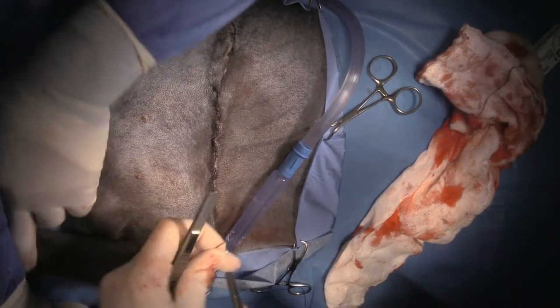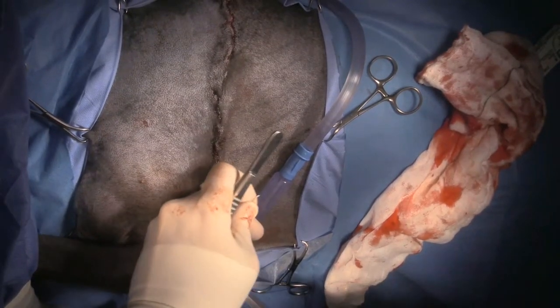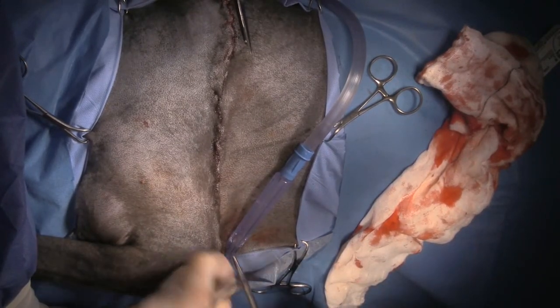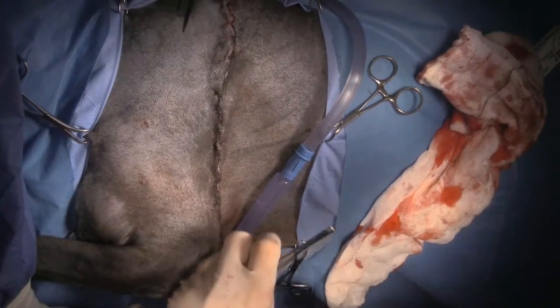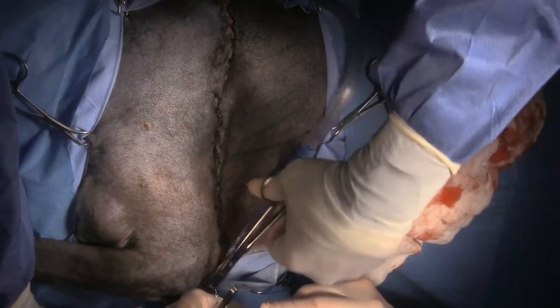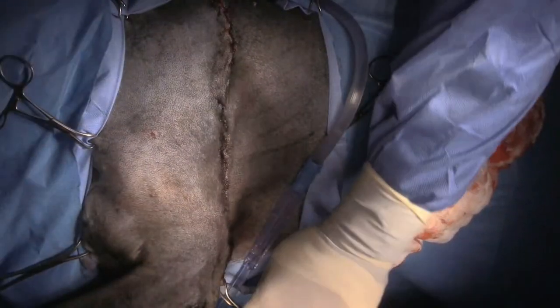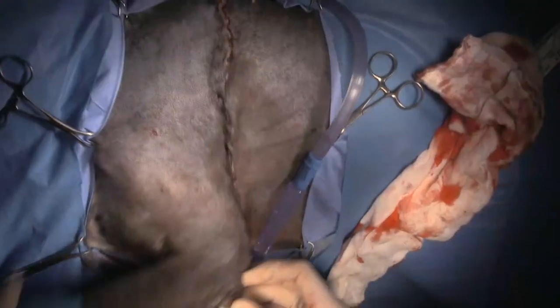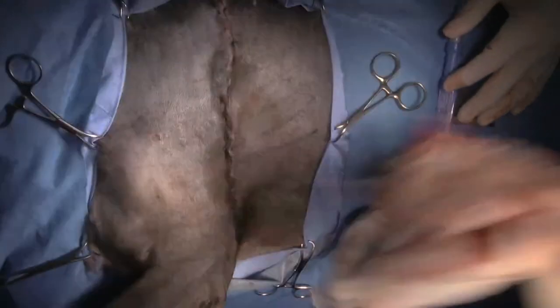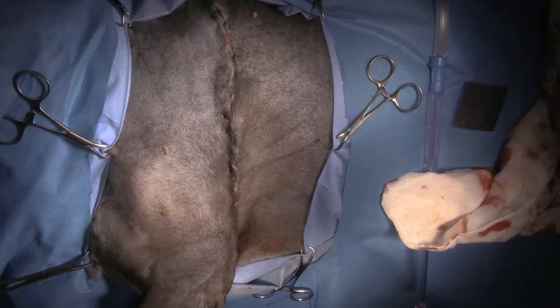Yes, it'll be more than 10 weeks. Yeah, that's fine. Okay. We can release that tower clamp. Let's see what kind of range of motion we've got. So the elbow's good. A little bit restricted, but that's good. Yeah, so that'll just scar down. All right, so I'm just going to come over and see if we've got any questions that I haven't answered yet.